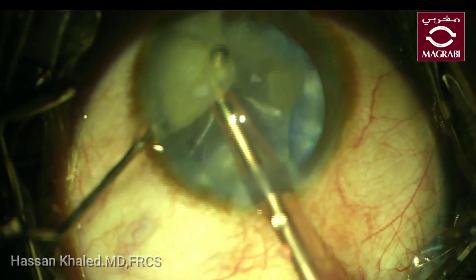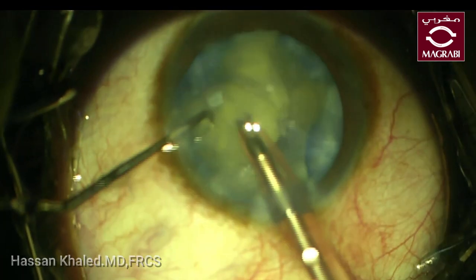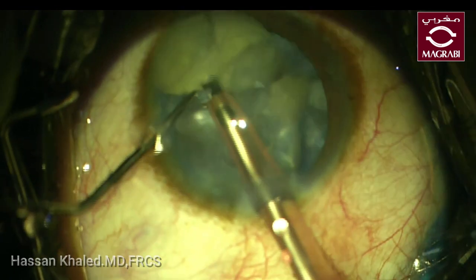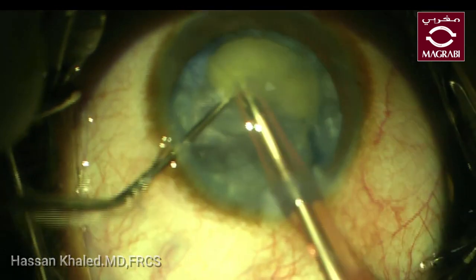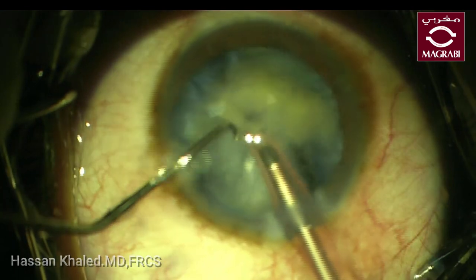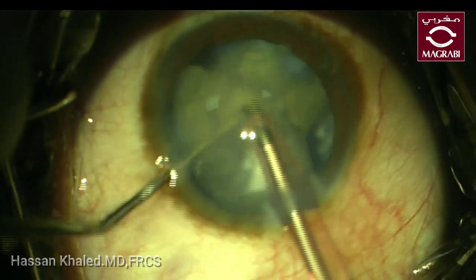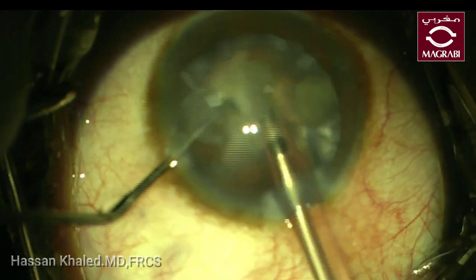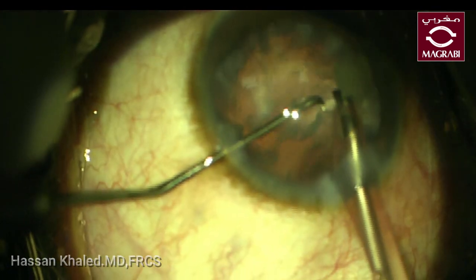If this flap is inverted inside towards the capsular bag and is not fluttering, that is a sign that there is extension posterior to the equator and that there is a tear in the posterior capsule.